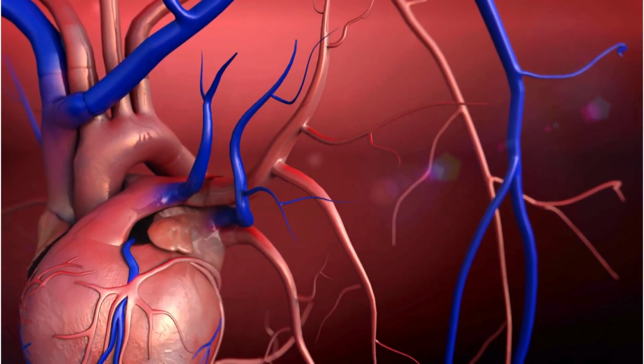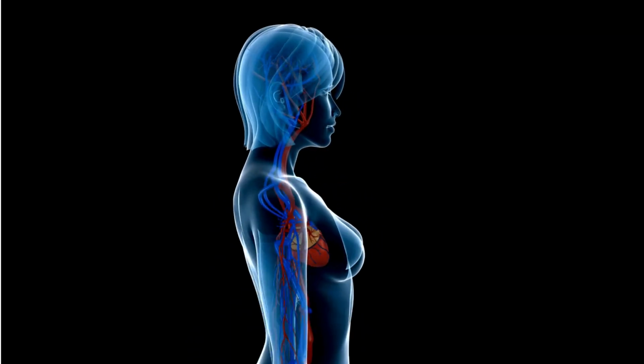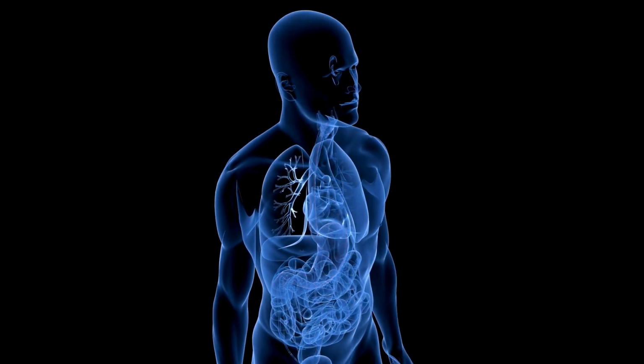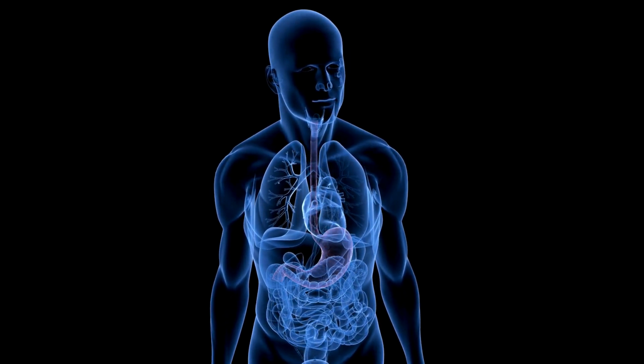Peripheral arterial stents. Peripheral arterial stents are used to treat blockages in arteries outside the coronary arteries, such as those in the legs, femoral or popliteal arteries. They can be bare metal or drug-eluting, similar to coronary stents.